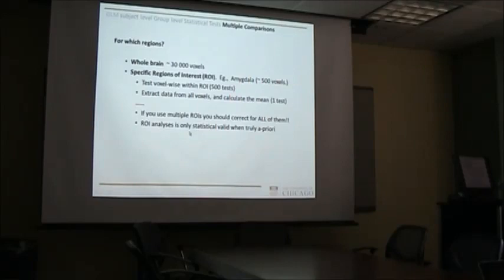What if you say, there are a lot of areas that look like they may be hot. I did my whole brain analysis, and now I want to go back and pick the highest 5 areas of interest. That would be okay if the test that you're doing is orthogonal to the way you selected that data.